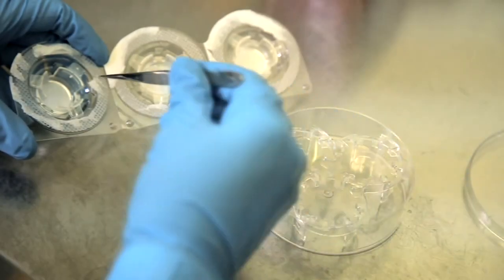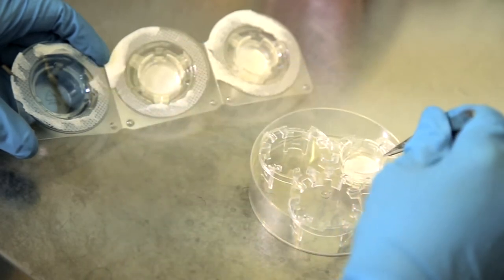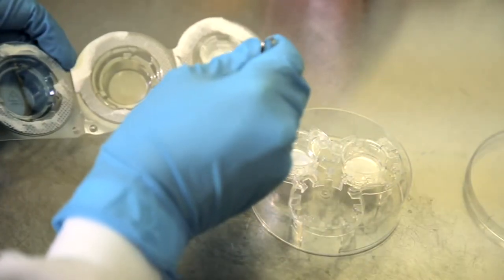Our well insert holder is designed to hold well inserts in a large volume petri dish, reducing the need for frequent media changes. This format should be used for prolonged cell growth of highly proliferative and demanding cell types.